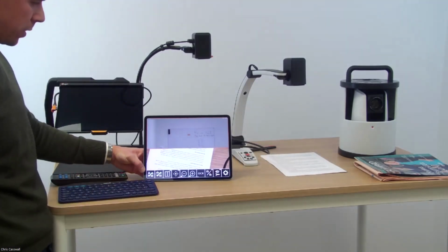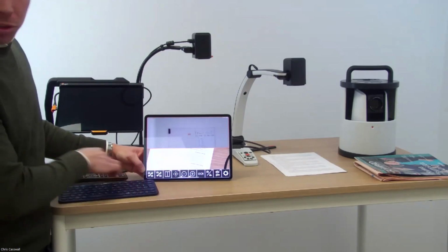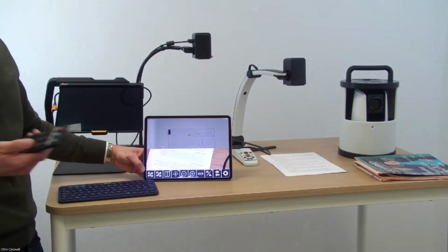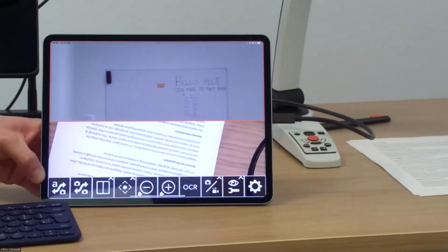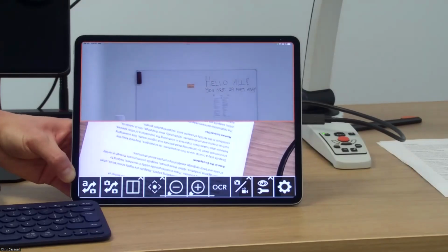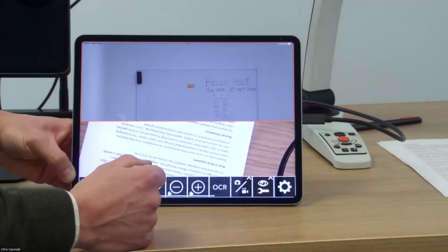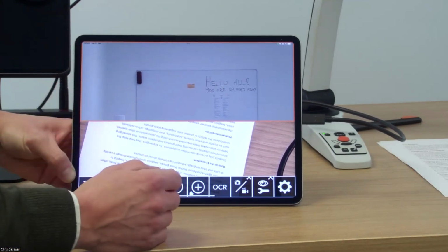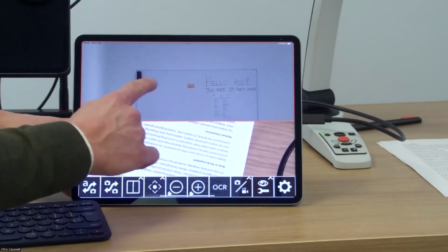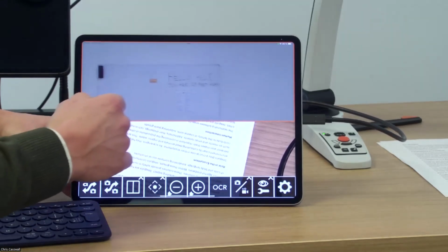We will not spend a ton of time on this, but just to demonstrate, oops, sorry, I almost forgot that I should come a little closer. So what's going on my iPad now is on the top in this split, I'm still within the LVI software on my iPad, and I am still live with the MagniLink Air Go because I never disconnected that camera.